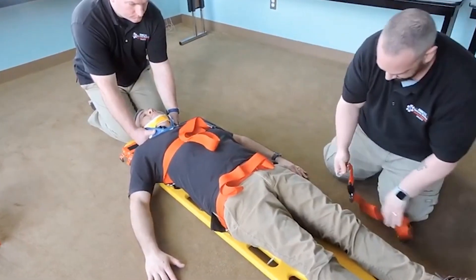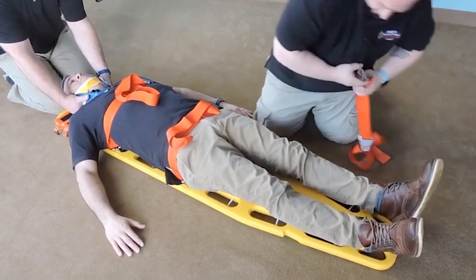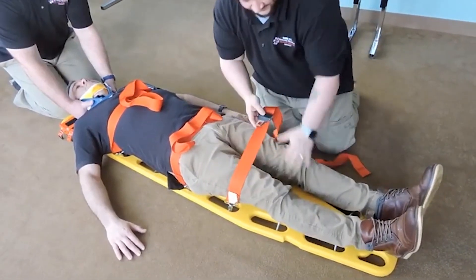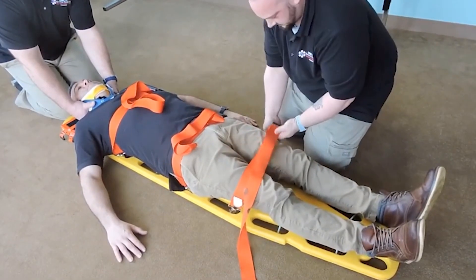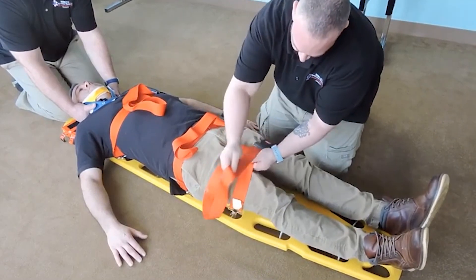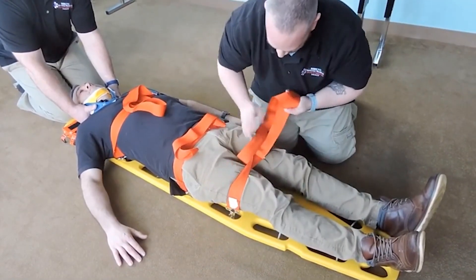You doing okay, sir? With the third strap, we want to immobilize the legs, so we're going to come above the knees where we have the majority of weight of the lower extremities. We would be padding in between the legs to keep them in a more neutral, comfortable position for our patient. Making sure we're not over the joint — padding between the legs and padding our buckle.